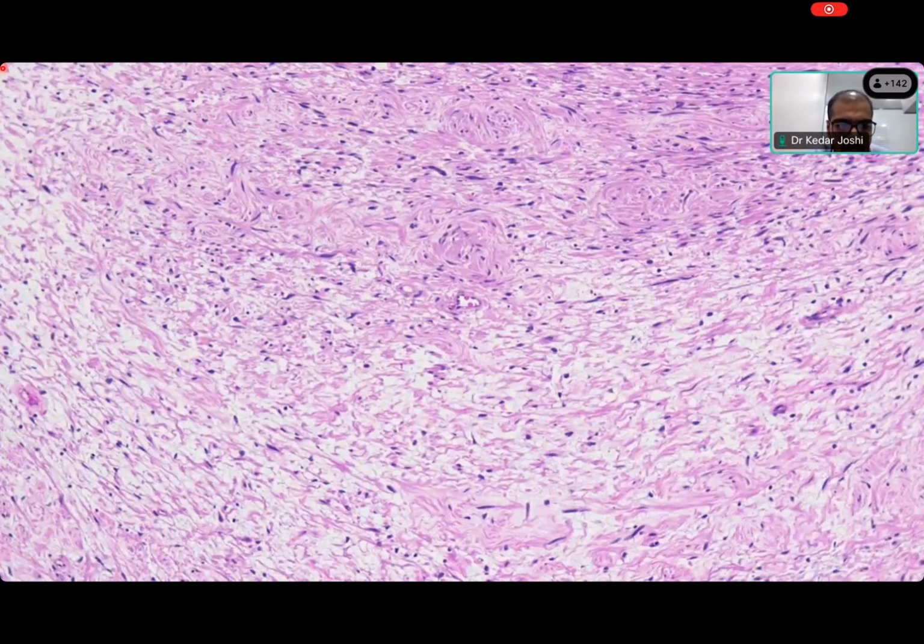Cells are spindle cells, ma'am. They are elongated in shape, having an elongated nucleus, and the pattern appears to be haphazard. I don't think so. No, there are fascicles. There may be interrupted fascicles and rather poor fascicles. You can see that. But what do you notice about these spindle cells, Kedar? And that's why it's important to make observations. Elsa, you want to help?